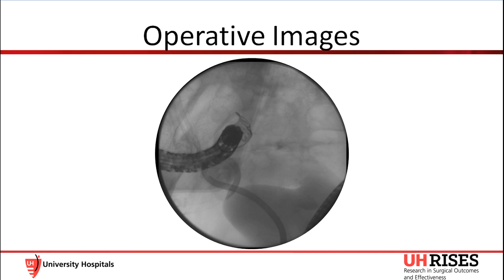After this, we removed our colonoscope and applied a 14T Ovesco clip, advanced through the stoma and back to the cecum. The clip was positioned over the fistula tract and fired. This was done using fluoroscopic guidance so as not to inadvertently close the ileocecal valve wall. Both were intact with good position of the clip after firing.